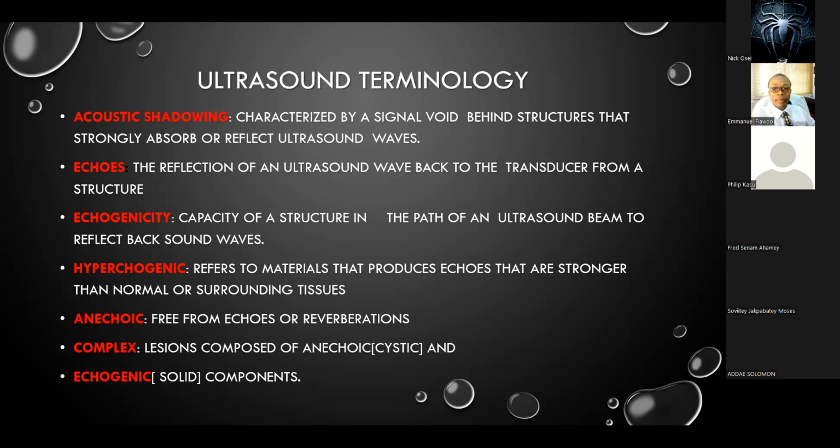It's just like when you stand between the sun and something, the shadow will fall so that the light from the sun will not touch that thing, for instance the ground. That is the same thing that happens when the ultrasound waves go through the body and hit structures.